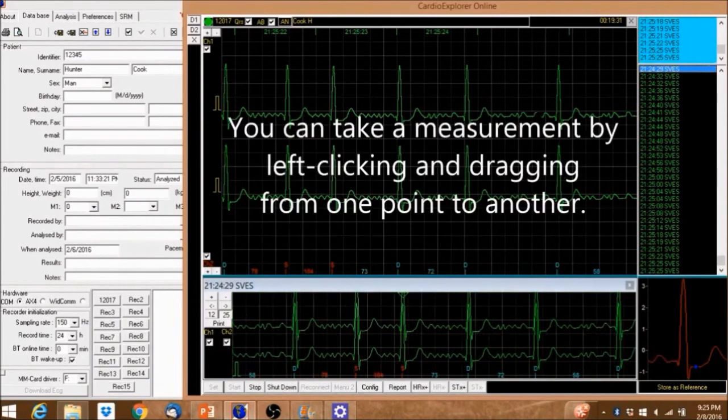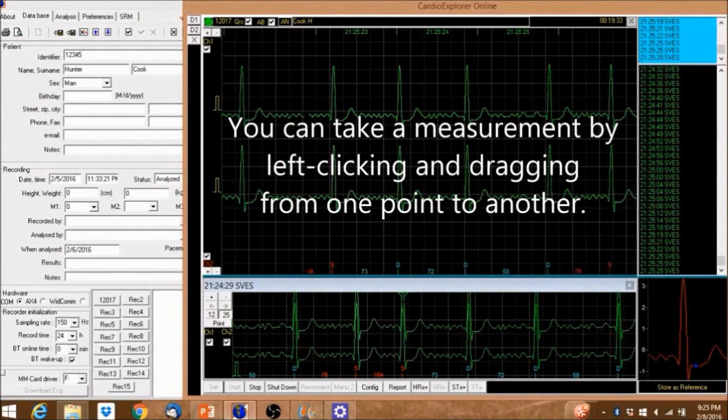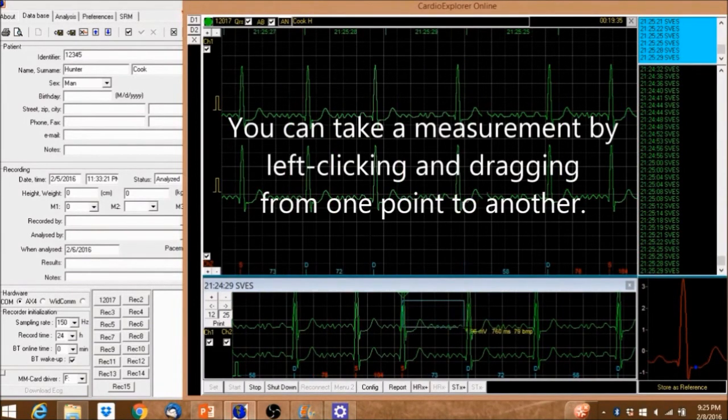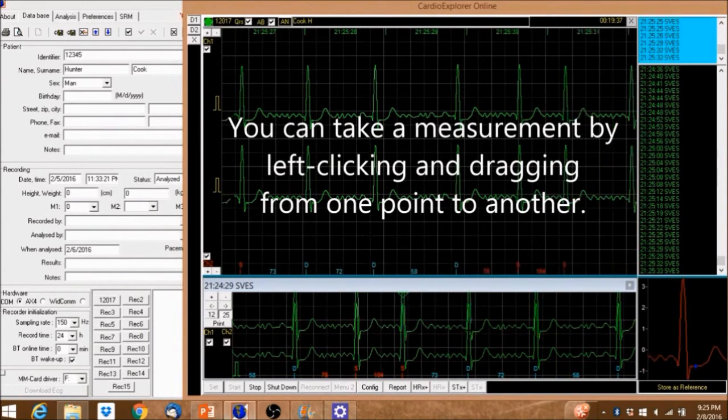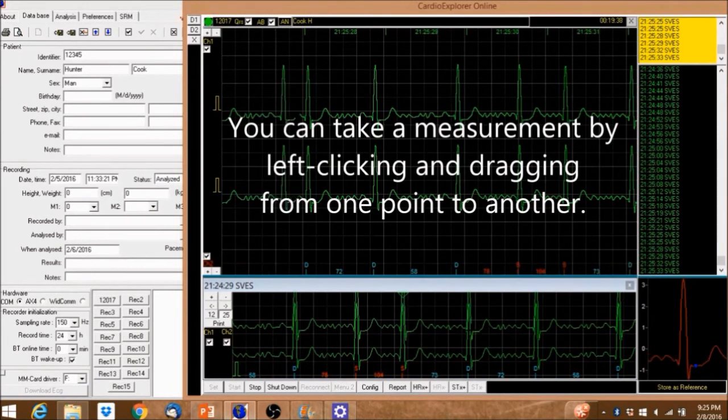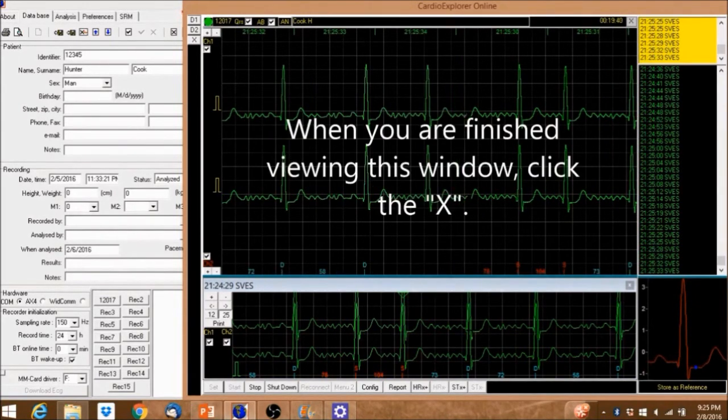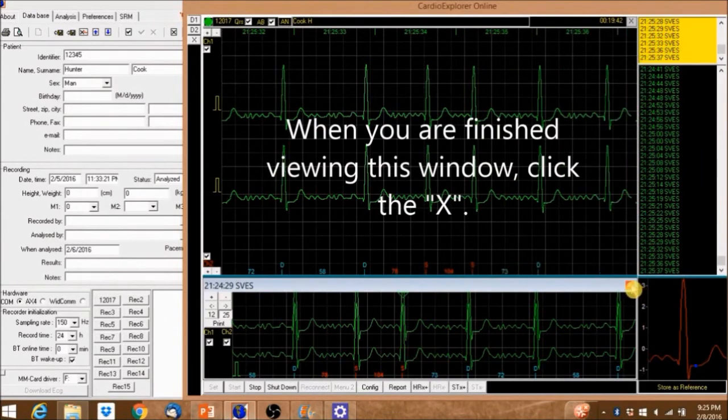You can take a measurement by left-clicking and dragging from one point to another. When you're finished viewing this window, click the X.